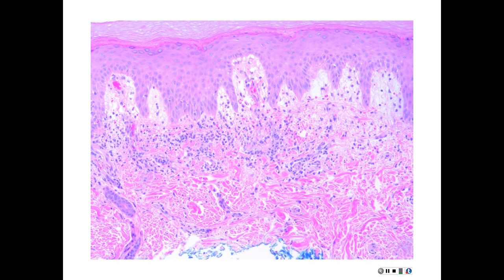And then this is your path. I see a lot of prominent papillary dermal edema. So papillary dermal edema, and do the lymphocytes sit on a background of pink, or are they surrounded by white? I think they're surrounded by white. And so lymphs surrounded by white in a vessel is a description of fluffy edema. So if it's on an acral surface with papillary dermal edema and fluffy edema in the vessels with lymphs, then you would think perniosis at the top, which is exactly where you started and what it turned out to be.